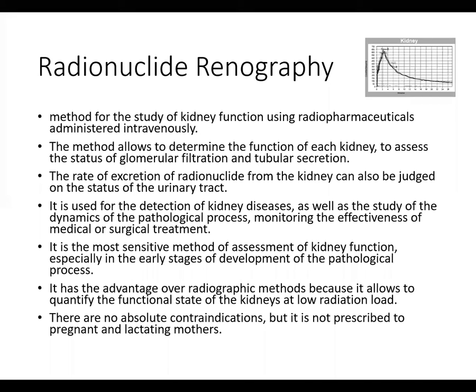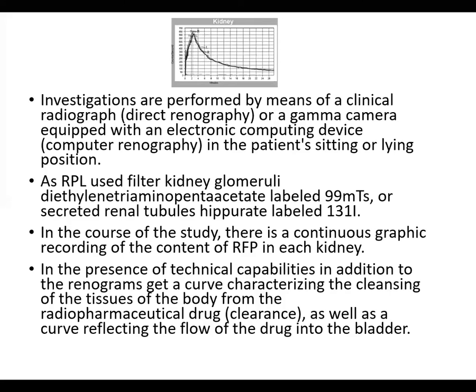It is the most sensitive method of assessment of kidney function, especially in the early stage of the development of the pathological process. It has the advantage over radiographic methods because it allows us to quantify the functional state of the kidneys at low radiation load, which is very important. There are no absolute contraindications, but it is not prescribed to pregnant and lactating mothers.